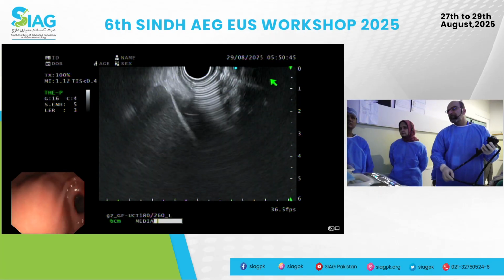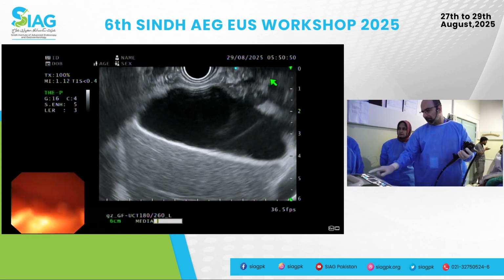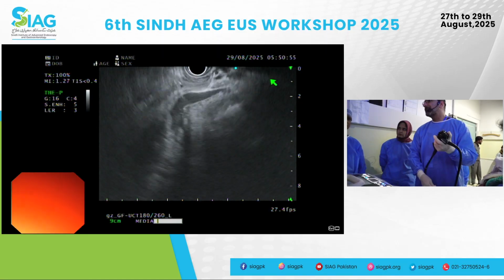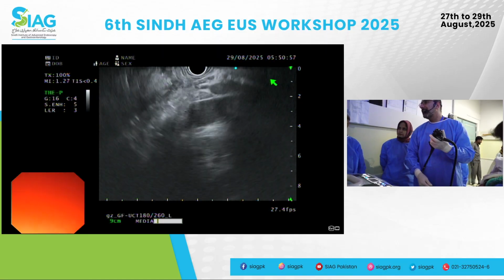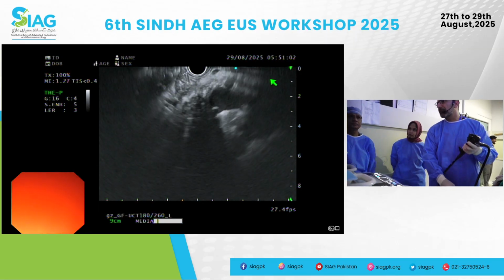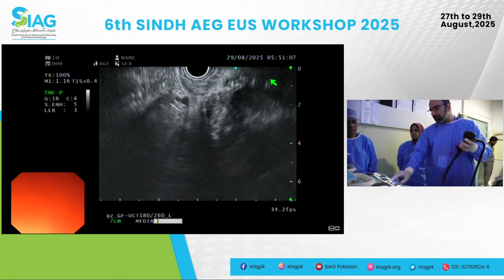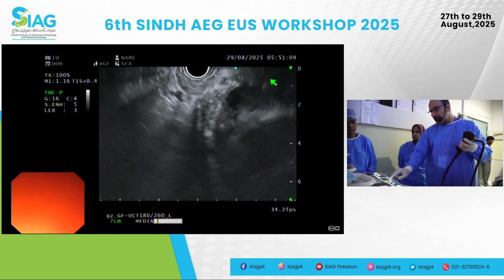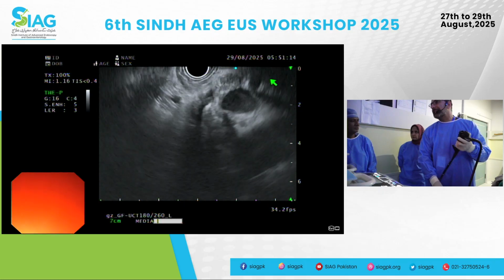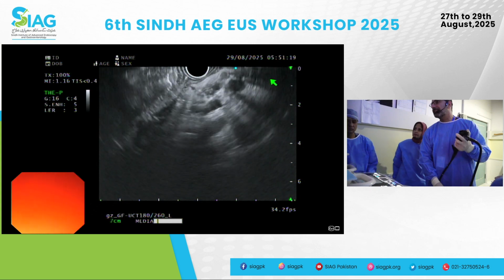The other thing that I wanted to show here: the gallbladder is intact, but slightly full, but that's okay. The chronic pancreatitis changes obviously are pretty profound. He does have some echogenic debris and sludge in what looks like the uncinate process. And here's your pancreatic duct. This is not uncommon in patients who have EUS after a PD stent, that the duct will be dilated and there will be debris inside, but that's the stent. You can see how atrophic this gland is.